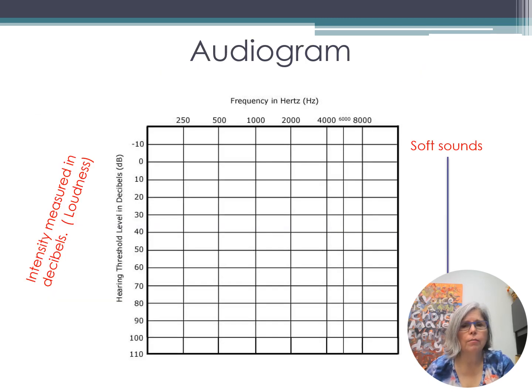First of all, the audiogram is a graph that looks like this. We measure in octave measures: 250 hertz, 500, 1,000, 2,000, 4,000, and 8,000 hertz. Audiograms generally have another line in between at half octaves because in the case of some hearing losses, those additional frequencies will be measured.